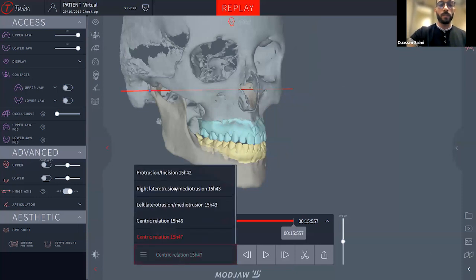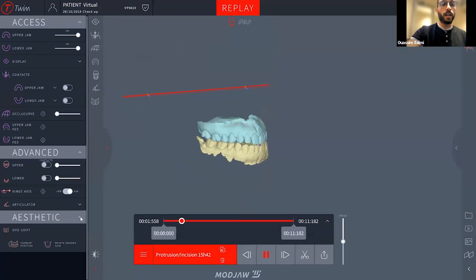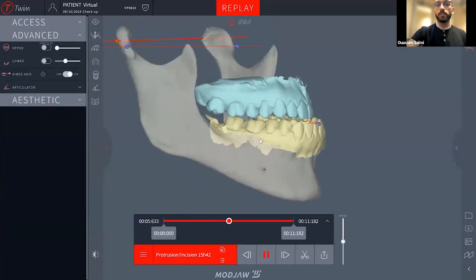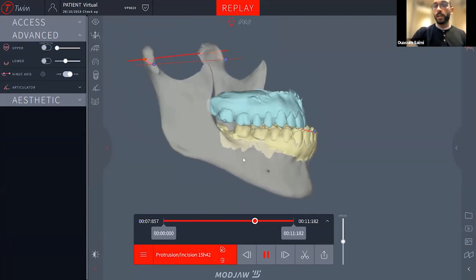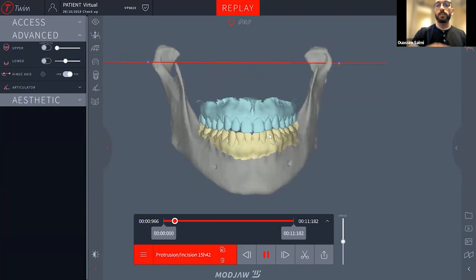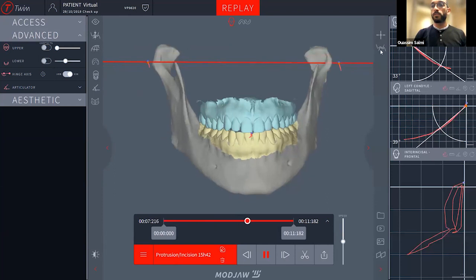So here, for example, if you replay the movement of the patient, the recording was done with just the 3D models. But then if you import the CBCT inside, poof, that gives you an image. If you want, for example, to compare the position of the condyle in 2 different positions, you will choose something so interesting, which is the cut view. I really like this functionality.